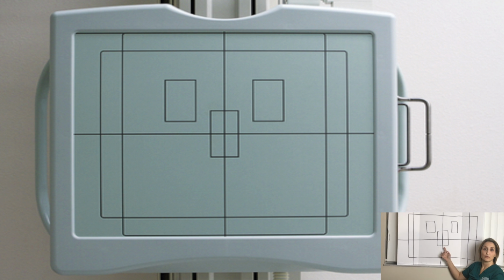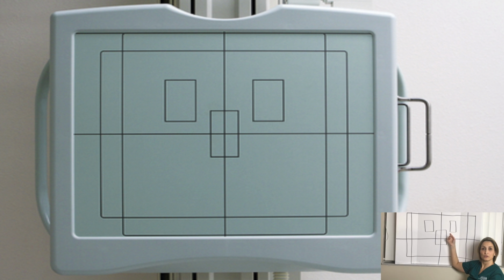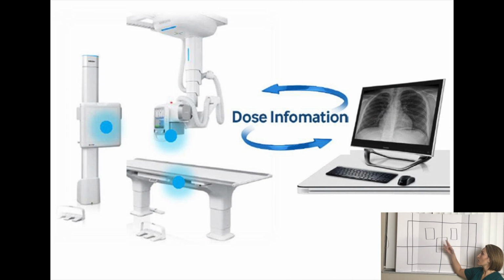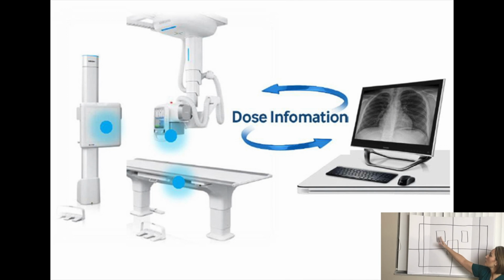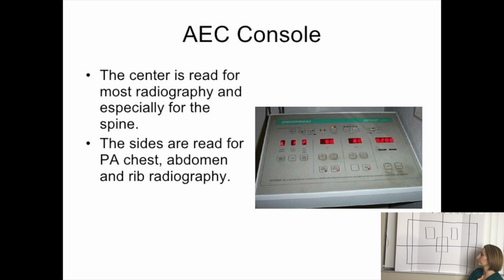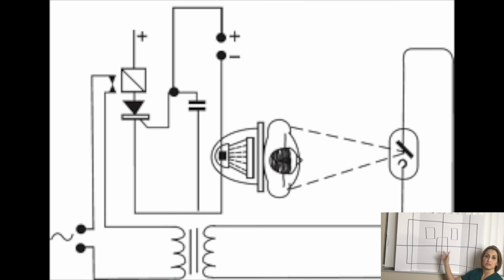Automatic exposure controls. As radiographers, we have the task to select the best exposure technique in order to produce a good quality image, but more important, a diagnostic image. For that, we use several different equipment and patients with different body habitus too.